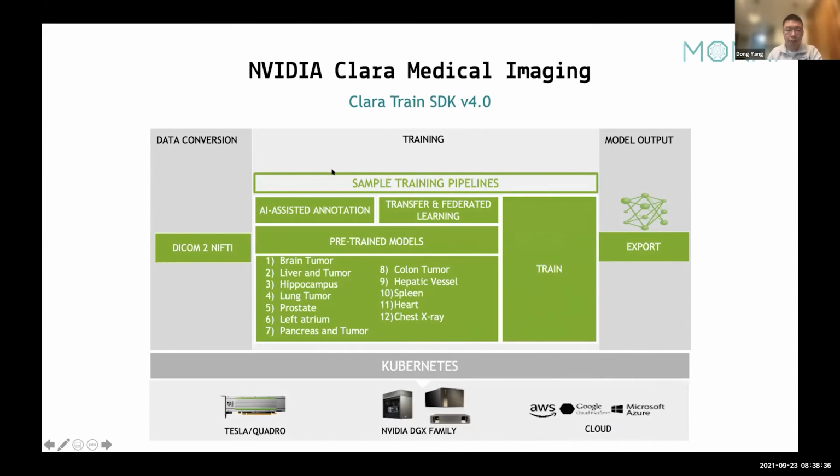The configuration for those applications fully leverages the components in MONAI, which means transforms, loss functions, optimizers, everything you can find, you can directly use. So even for your own application, you can use those examples as a reference and directly call MONAI transforms to train your own model.